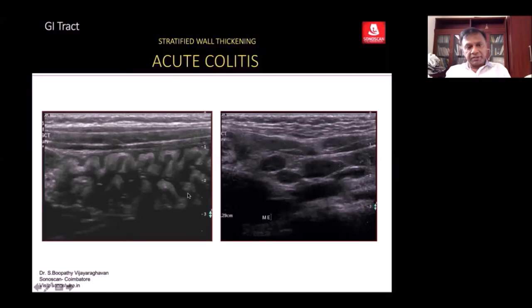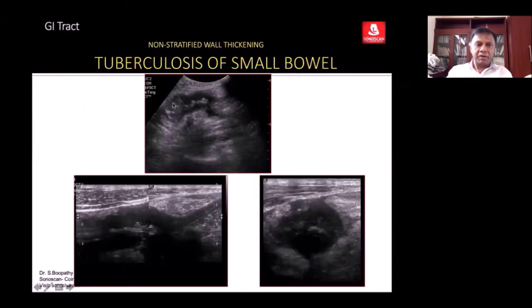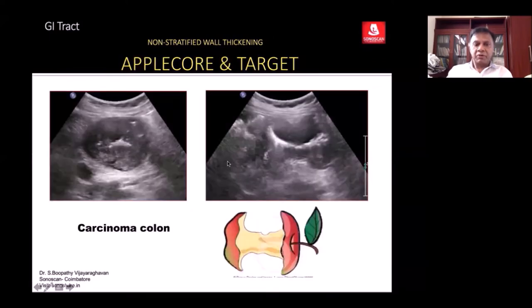In a patient presenting with diarrhea, pain abdomen, and fever, on the left side of the abdomen, a characteristic feature is fistula formation. This can occur in small bowel and with other organs. On high-frequency scanning, you see typical non-stratified thickening — the layers are not seen. The lumen is filled with gas, giving the pseudokidney appearance, indicating a tumor-like lesion — what is called the apple core or target appearance. In short axis it appears like a target, with non-stratified, short-segment thickening of the bowel.